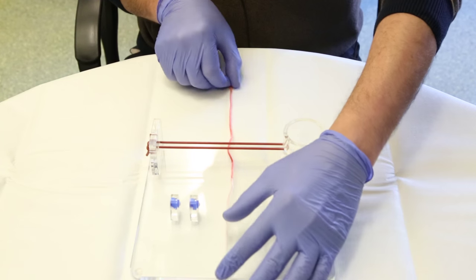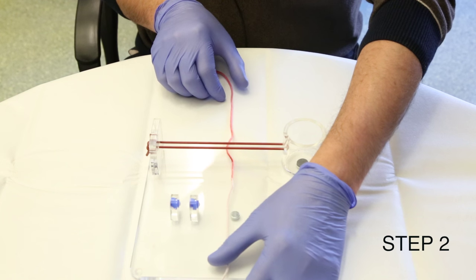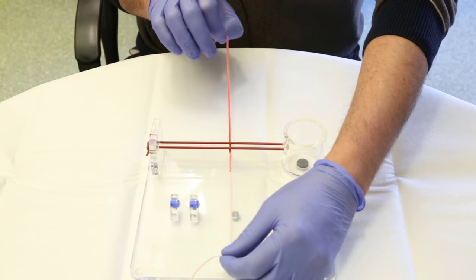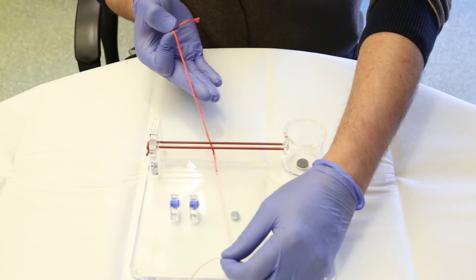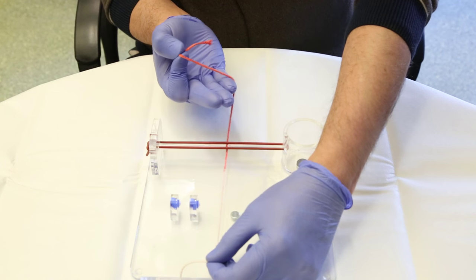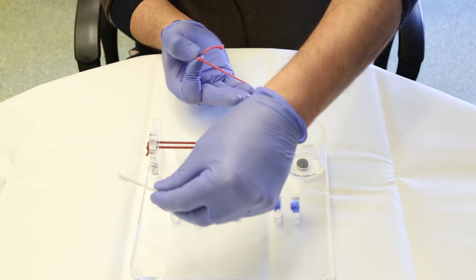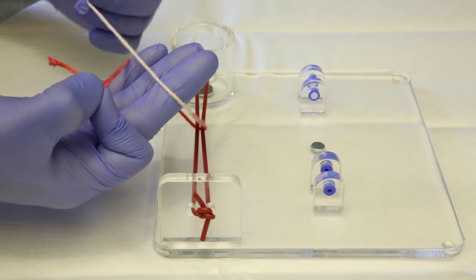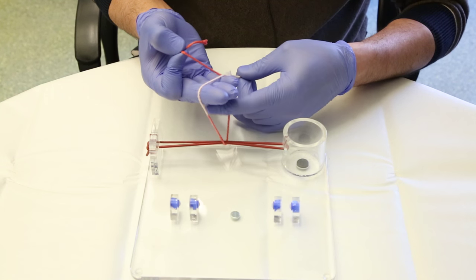Step one was setting up the tie. Now step two is to make the loop. In this step we hold the tie with the right hand with our index and thumb, and then we pass the rest of the tie across our other three fingers. We come with the assistant hand — the left hand — with the tie from the opposite side to form the tying loop.